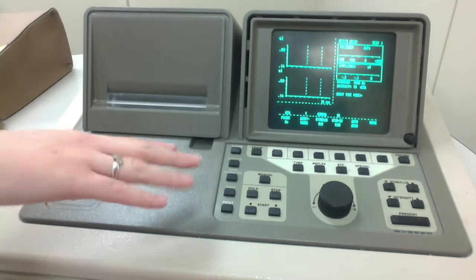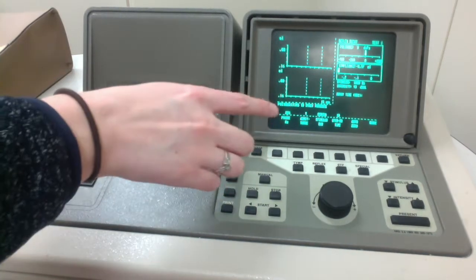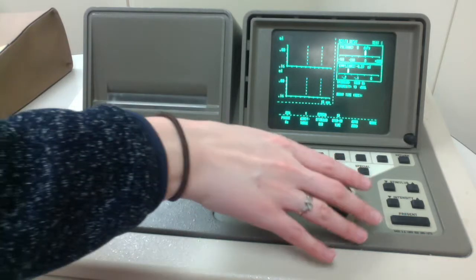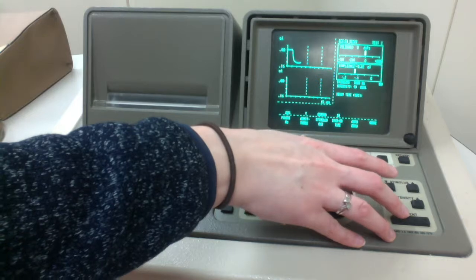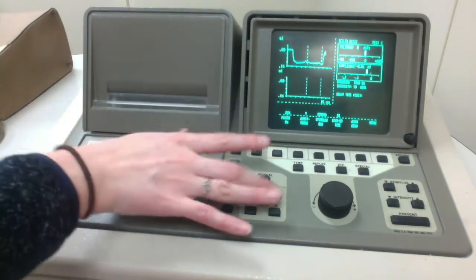I start by clicking start to equalize, to pressurize. And then I push present. Okay, and then I can push stop. I'm going to take those out.